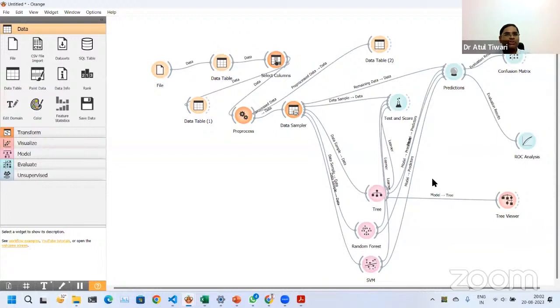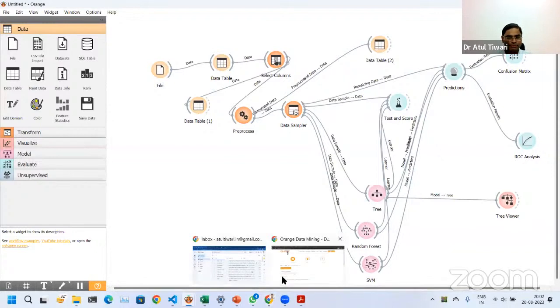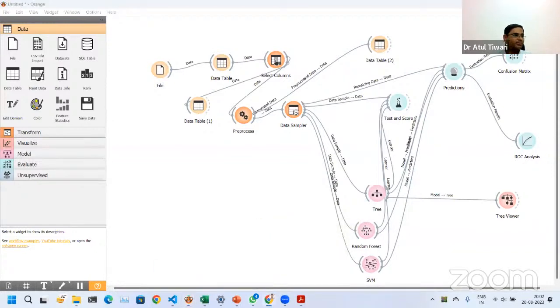If you have seen, there are some machines which are predicting in all the peripheral blood films, and that reporting is being done automatically now. I think even Mindray has a machine that can predict all the WBCs. So time is changing quite fast. We can even forget that we used to perform the PBF reporting by ourselves.